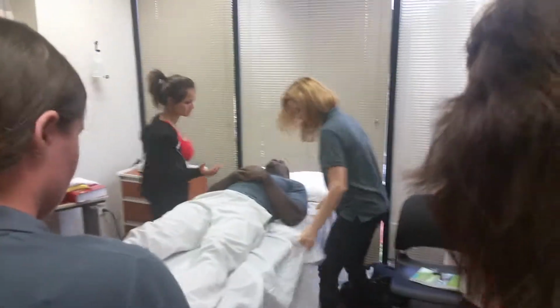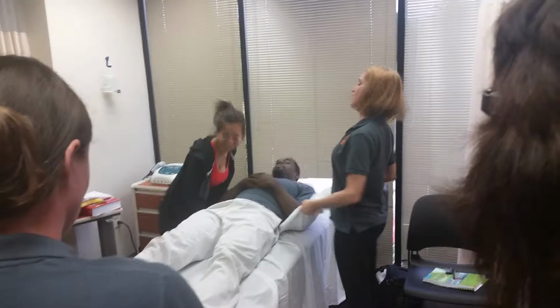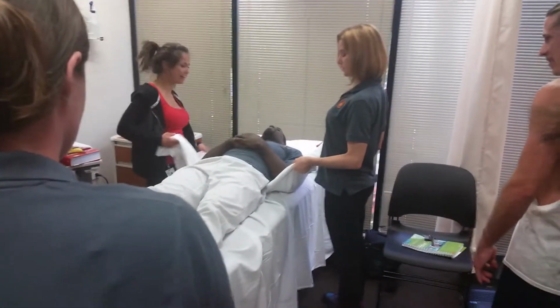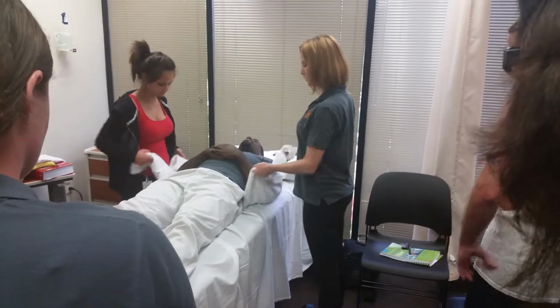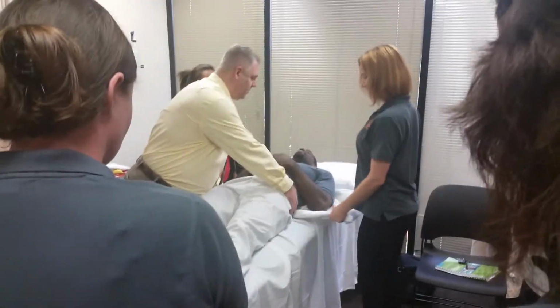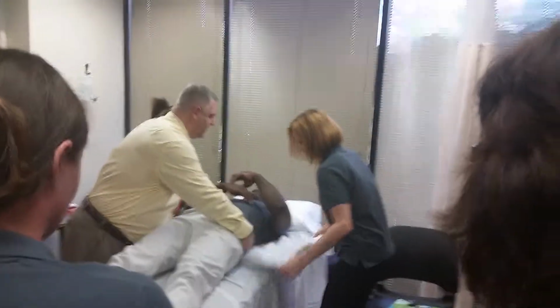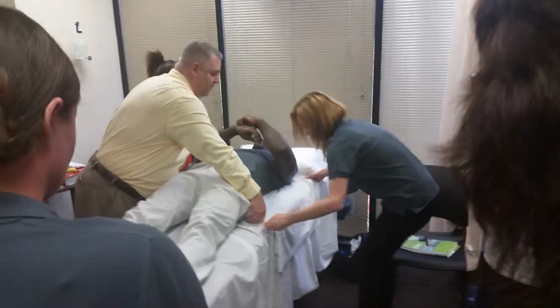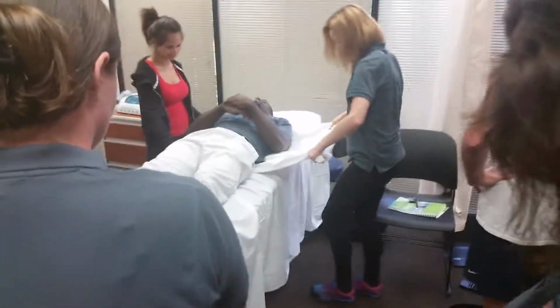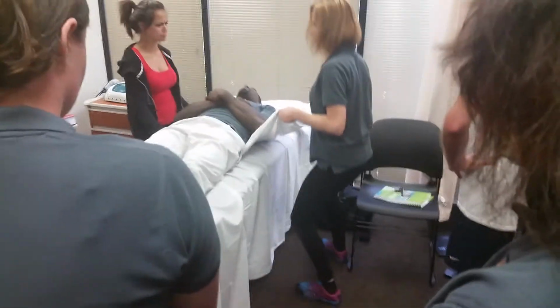Oh my goodness. Okay. Squat that, Danielle. Got my squats down now. She's got it now. All right. So who's going to be the leader? I'll be the leader. Okay, ready on 3. And hang on a minute, if you could bridge up just for a minute, it makes it easier. Let me pull this over, now more towards you. There you go, okay. All right, so you got it, good.